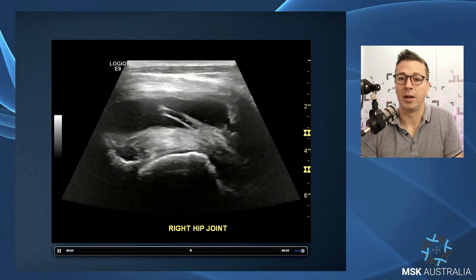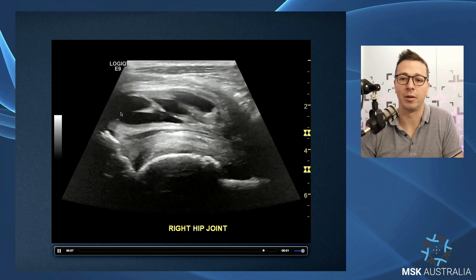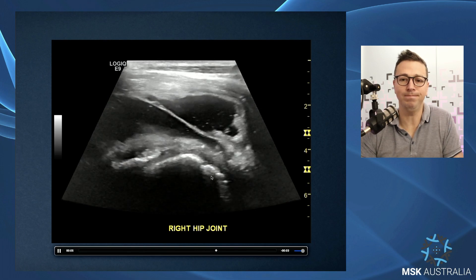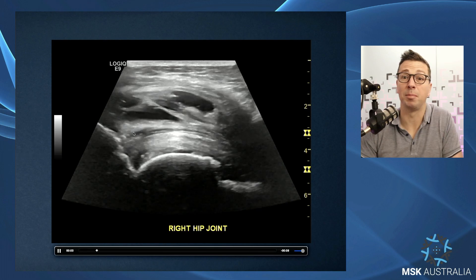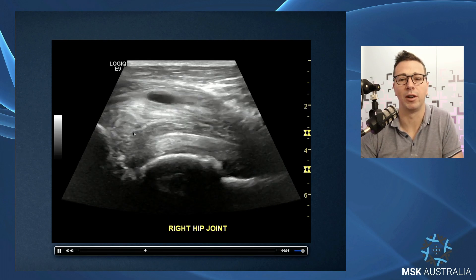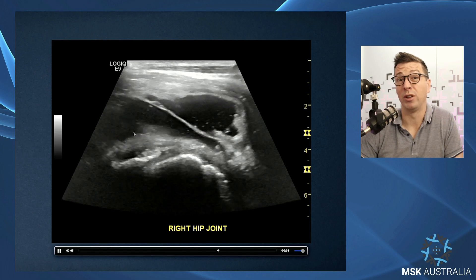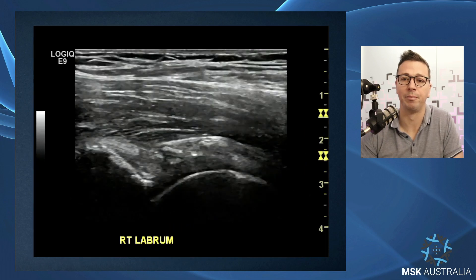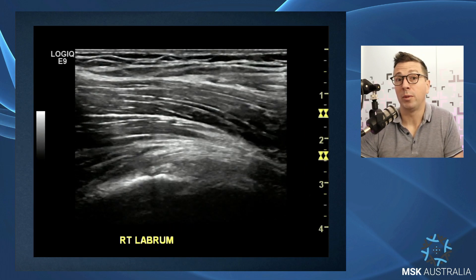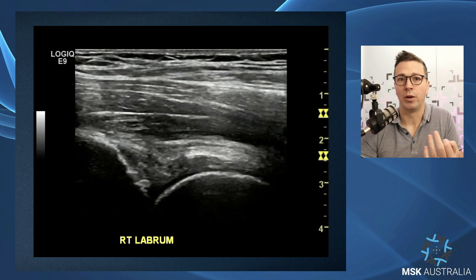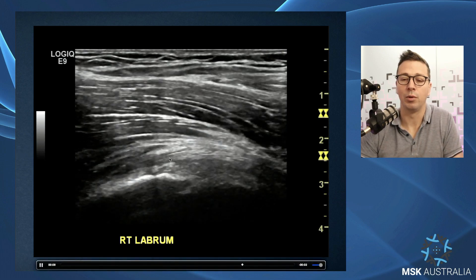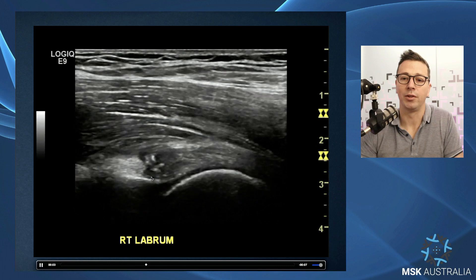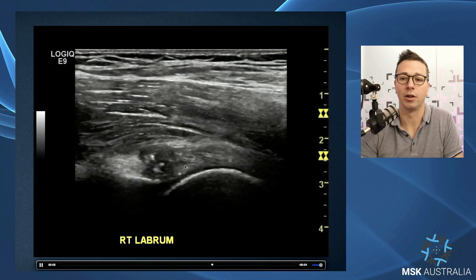Labral tears and paralabral cysts can become very large, particularly in a grossly arthritic hip joint. These anterior paralabral cysts can extend up and around and underneath the iliopsoas — they can become really big, extending the whole length over the hip joint capsule and infiltrating through iliopsoas. In the younger patient without much underlying osteoarthritis, treatment involves an anterior labral repair, which sonographically shows a bony anchor and suture material through the anterior labrum.